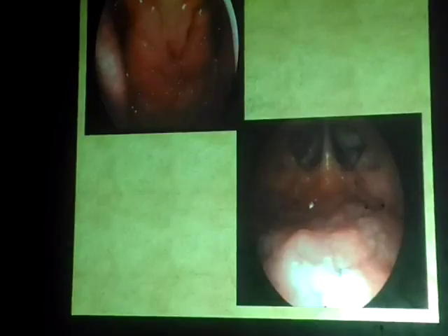This is another endoscopic view. You can see this is the torus tubarius, the eustachian tube orifice, the fossa of Rosenmuller. This is the vomer, the choana, and the posterior end of the inferior turbinates, and this is the adenoid. This square area is the area you have to work with. You don't have to go laterally or superiorly, or you are going to injure any of these structures.